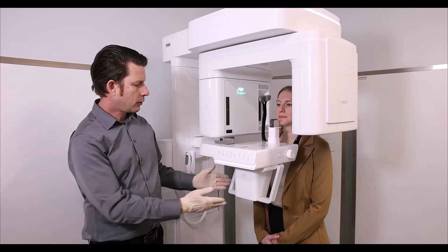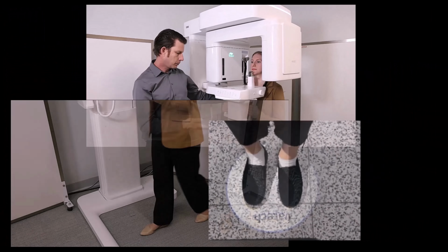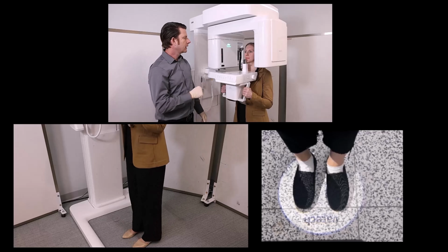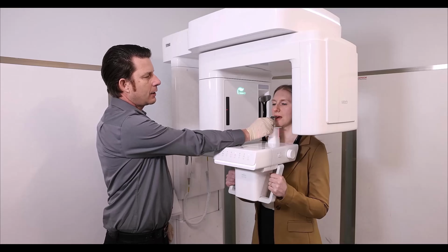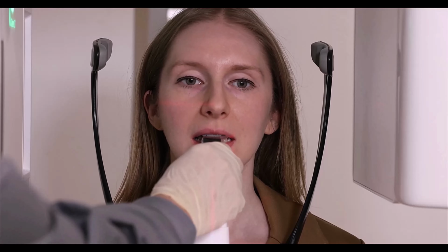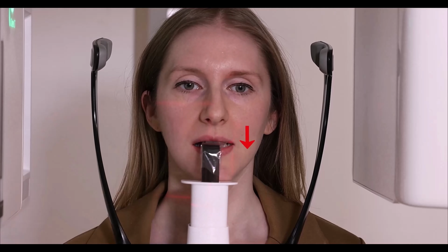So first thing, let's have you go ahead and hold with your hands on the hand rests. Go ahead and walk forward, and you'll put your feet in the puddle lamp. And I'm going to guide them into the device. Go ahead and open and gently close on the bite stick, and I want to make sure their anterior teeth are in that groove. I'm going to gently push down on the bite stick.